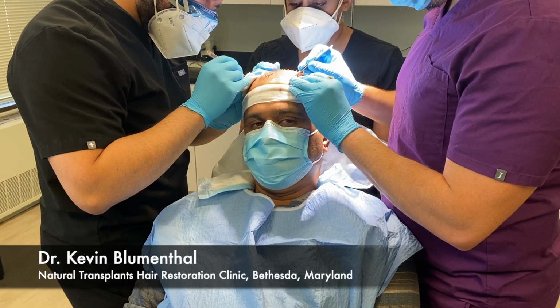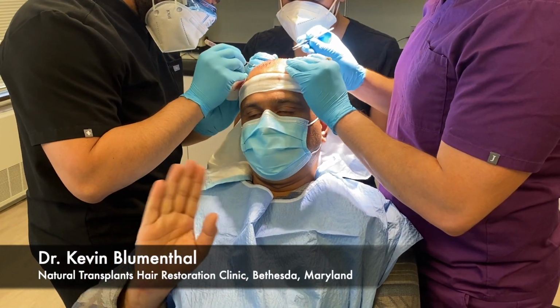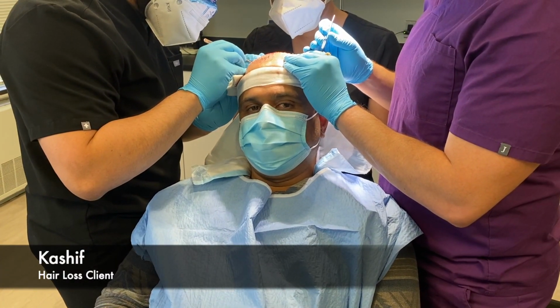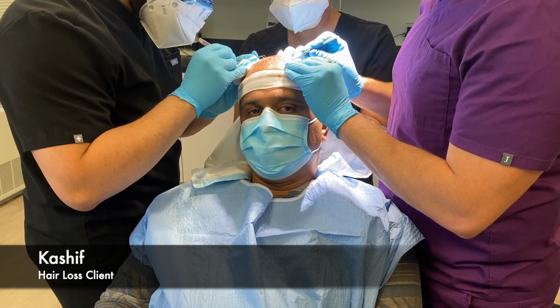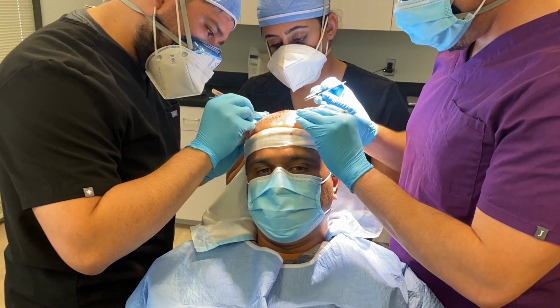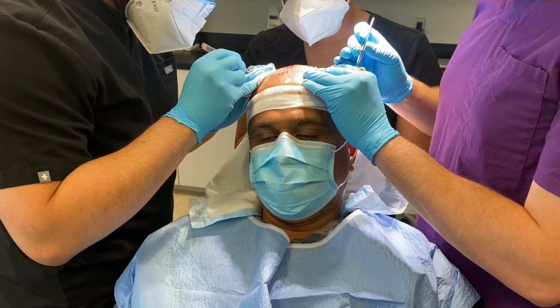All right, we are back with Kashif. Kashif, how you doing, man? I'm doing well. Doing okay? Yep. So we've taken the strip out, strip's been cut up, we've placed all the slits, and now the techs are placing all the hairs within the slits. And we probably have about 20 more minutes, 30 more minutes to go, something like that.